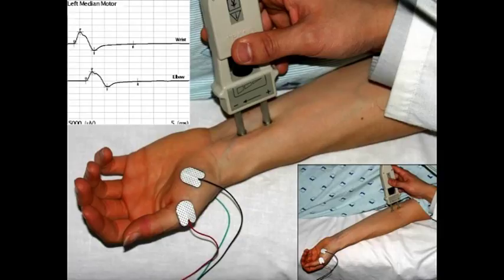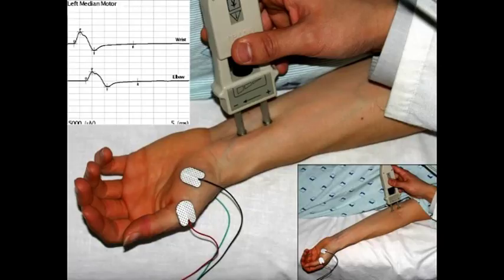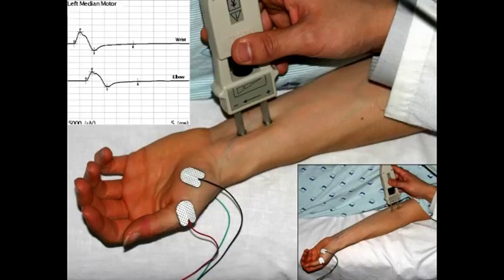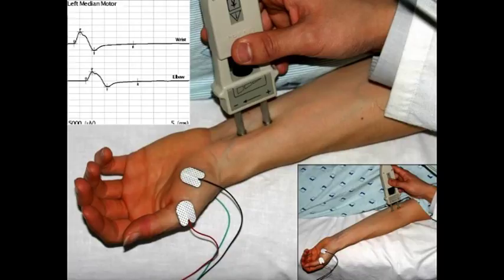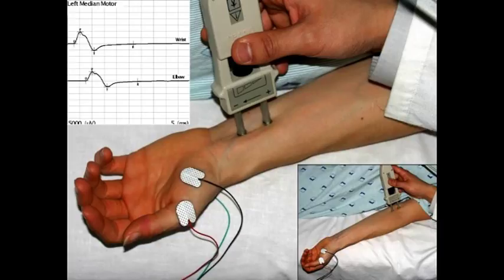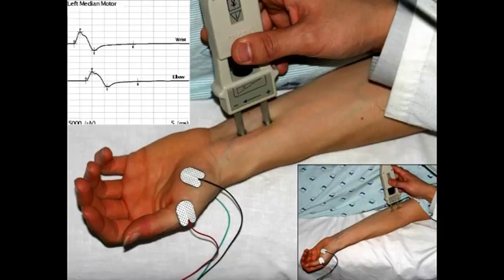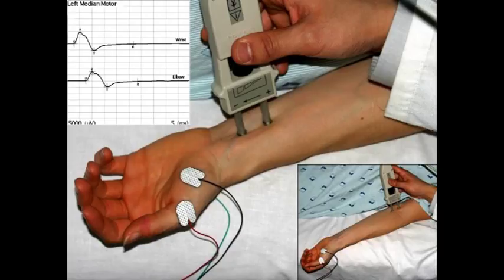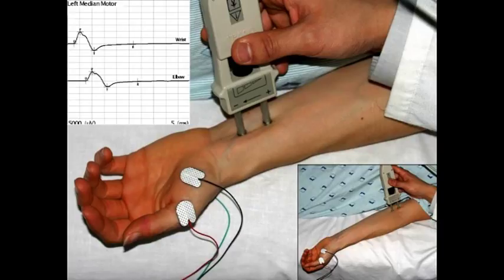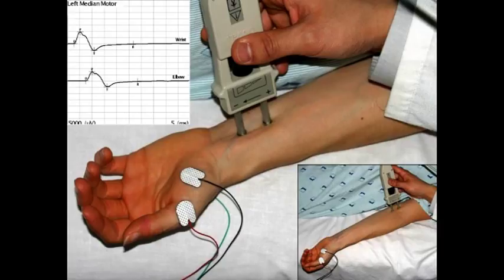If there is a delay in conduction — often due to carpal tunnel syndrome, demyelinating neuropathy, or Guillain-Barré — the distal latency will be prolonged by about 20% over normal. We have normals for each nerve's distal latency. For the median nerve, it's 4 milliseconds. We stimulate proximally because there's another process — neuromuscular transmission — that occurs between the action potential arriving and generating the muscle response, so you can't just measure the distance from one point and divide by time.